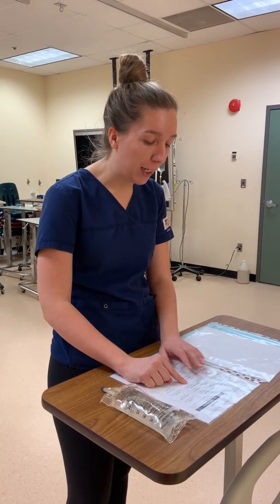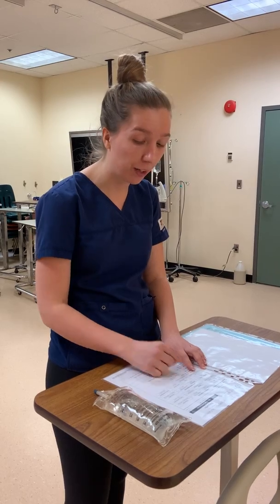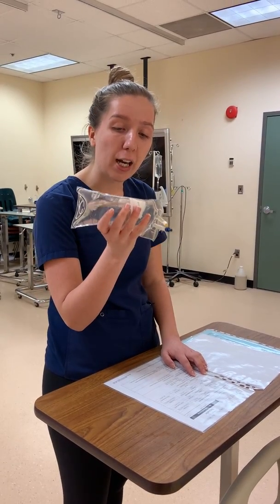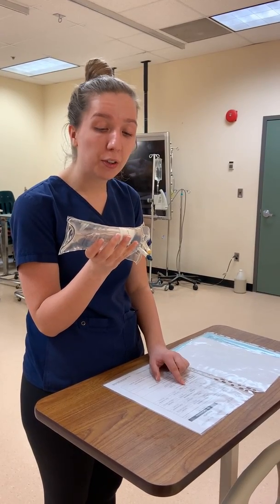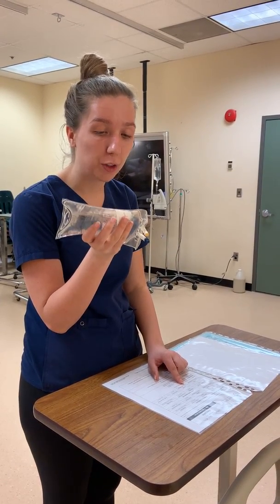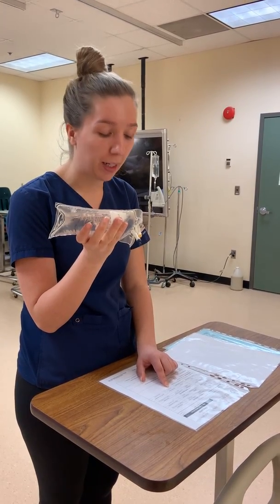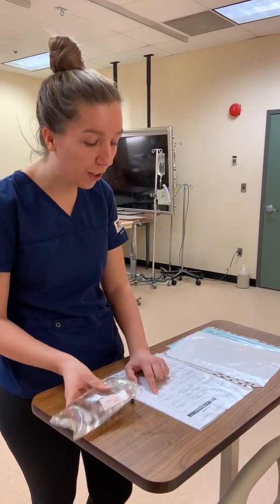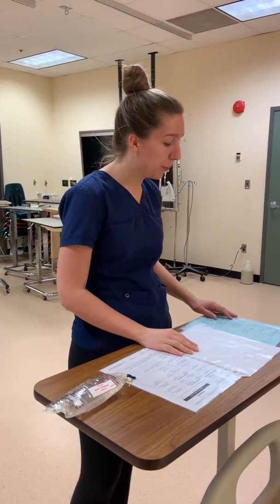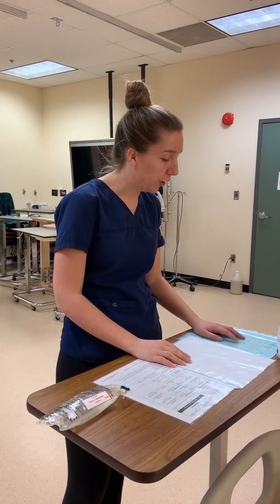The channel display will say heparin VTE. Now for the drug, I need a pre-mixed bag of 25,000 units. I see here I have the pre-mixed bag of 25,000 units. The diluent is 250 mLs. I have a diluent of 250 mLs. Same with the final volume of 250 mLs. That is what I have here, giving me a final concentration of 100 units per mL. With the final concentration of 100 units per mL, I will be able to retrieve the prescribed dose of 1350 units an hour. So I've completed my first check.